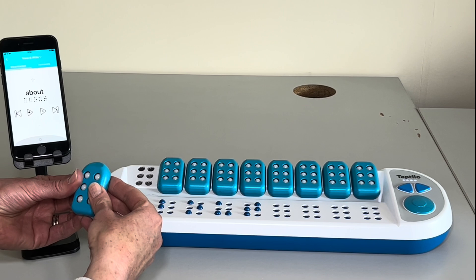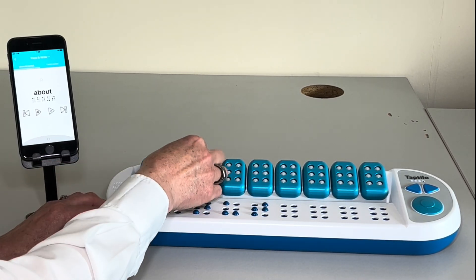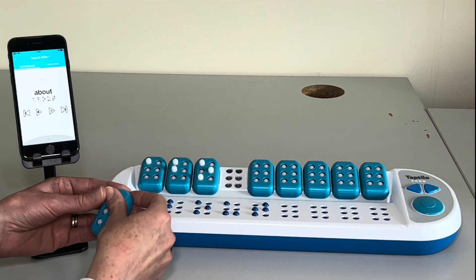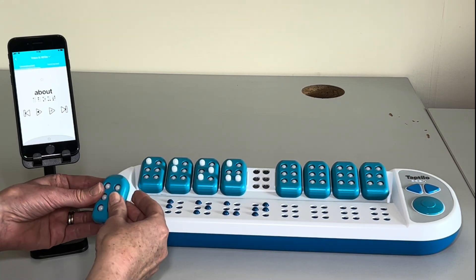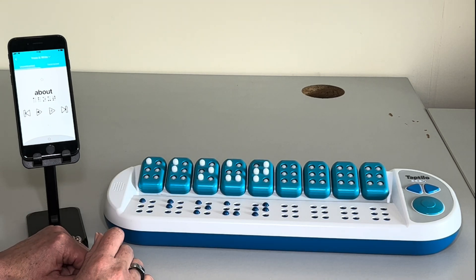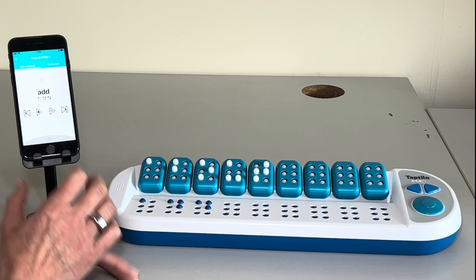And I can do my braille symbols on the cells — O, U, and T. And then the student can press the circle button. Great, and we've got it right. And we go on to the next one.